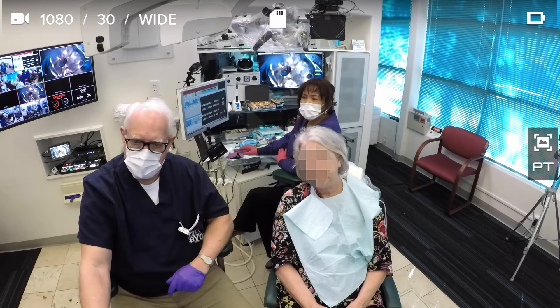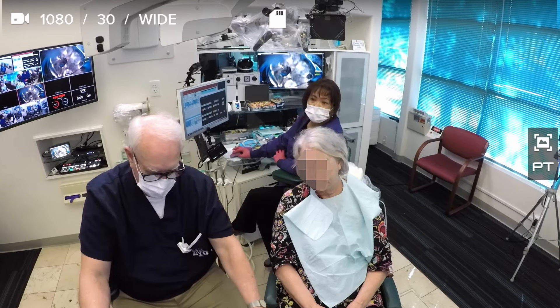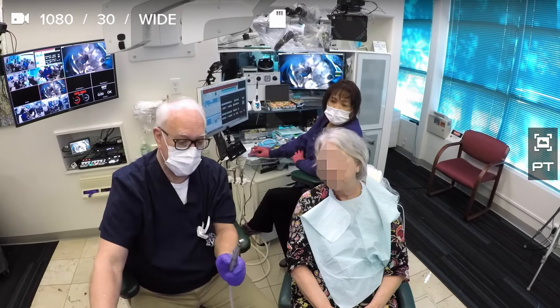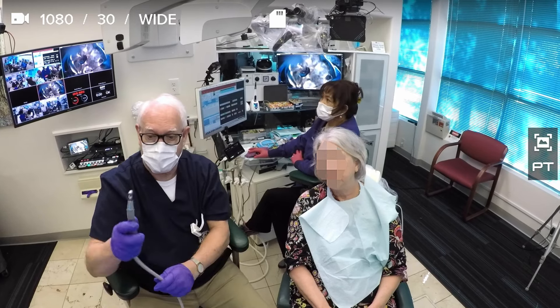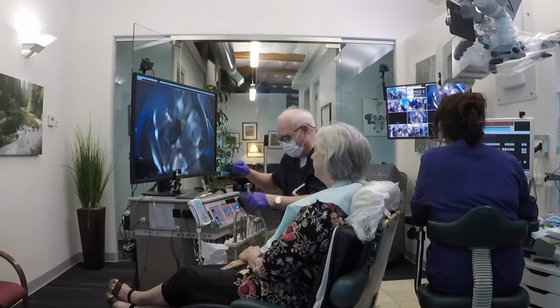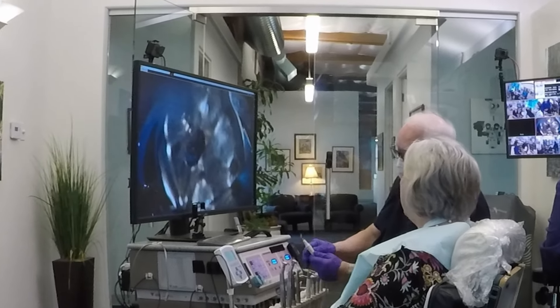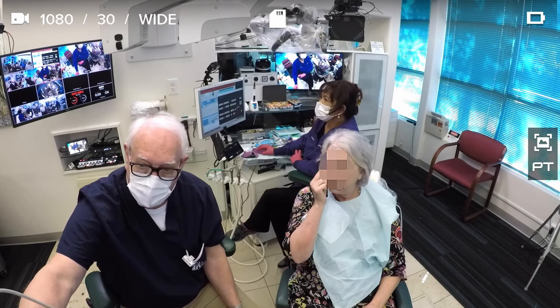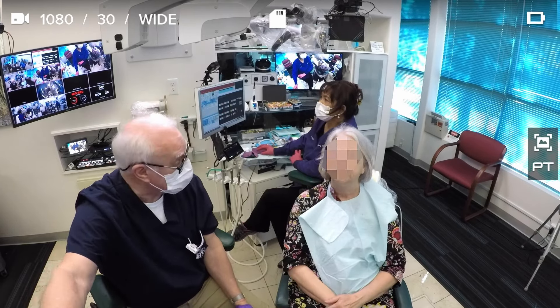So now I've gone in there, and one of the problems — or one of the solutions I've been involved with — is that this is typically done with a handpiece. If I take my handpiece, my handpiece covers the whole thing. I can't see anything. I don't know where I am. So we developed these ultrasonic tips, and I can cut the tooth. So I go in here and I'm kind of troughing back and forth, and I can see. I can see what I'm doing.